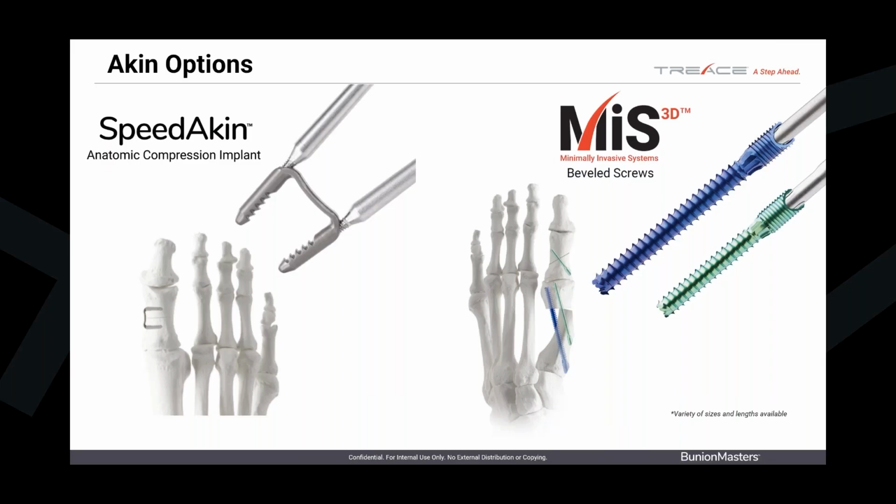My advice to you is get comfortable with the burr at some point. Patients are looking for that. They're looking for minimally invasive surgeons to do other stuff like DMMOs and hammer toes and percutaneous bunions. And so I want you to be comfortable with that. So try to cut your teeth on the burr usage with the Akin. And so if you do a burr osteotomy, then you can correct it with one of our beveled screws that the percuplastic technique has. So keep that in mind.